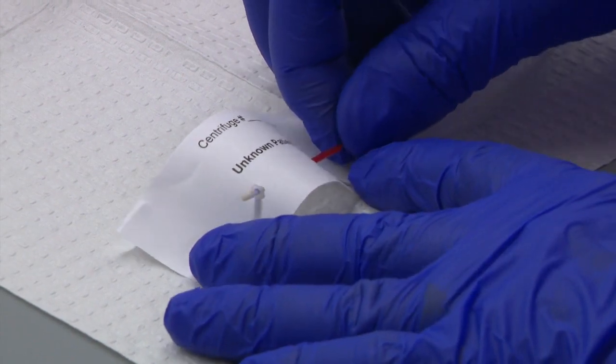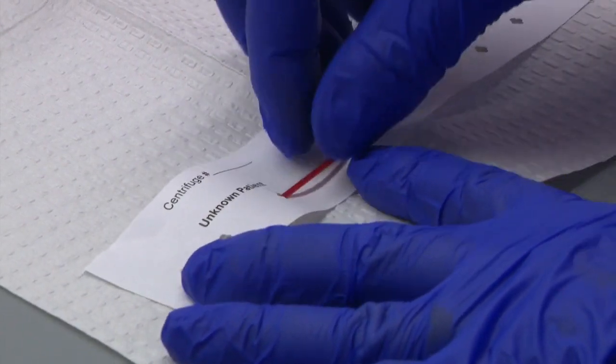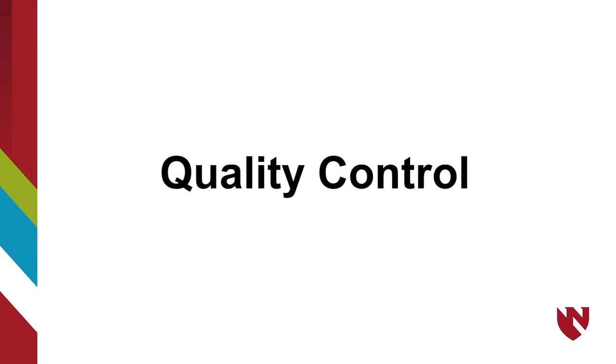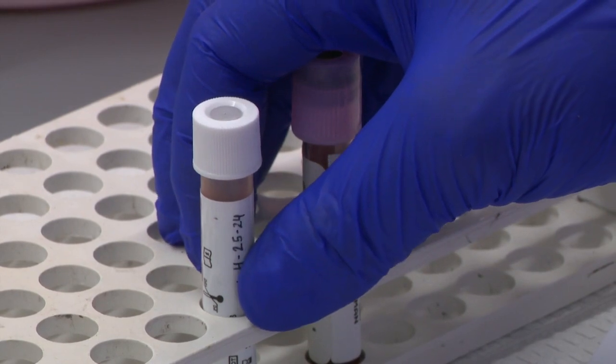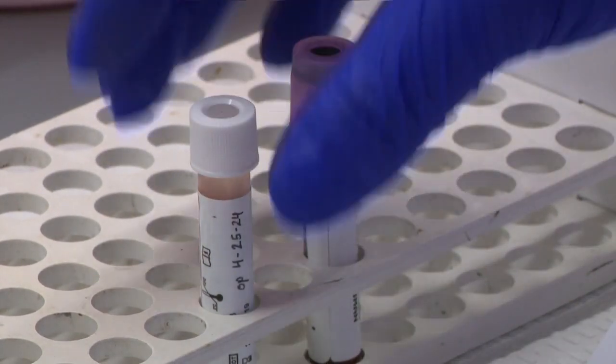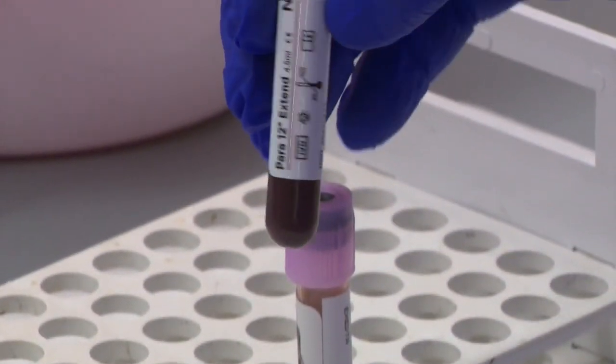Once blood tubes have clay plugs, place tubes in the hematocrit sheet holders. Now we are going to repeat this process with the control vial once again, filling two tubes because we perform this test in duplicate.